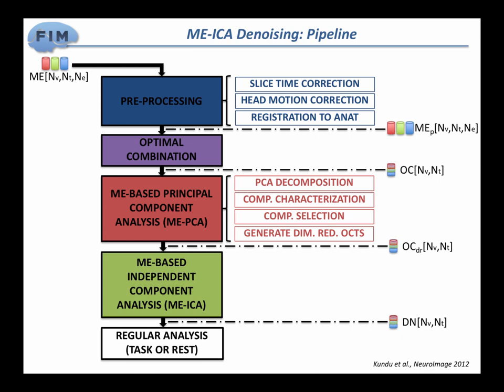So it depends why you're doing filtering. Let's say you're doing filtering just to get rid of physiological noise, because you have super well sampled data and there is no overlap. Well, you can do it first, and that should be fine. I said about not doing it because initially I like it when I look at my components, because I don't trust the algorithm fully, and I want to sometimes evaluate whether the algorithm makes some mistakes. Seeing the high frequency components in the time series helps me a lot.